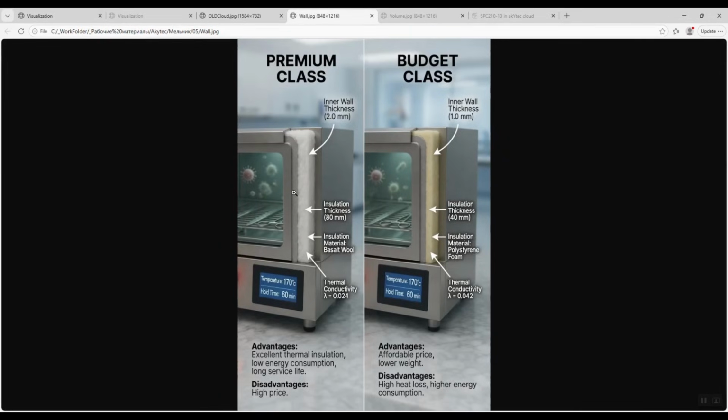The thicker the metal walls and insulation, and the lower the thermal conductivity coefficient of the insulation material, the better the sterilizer chamber retains heat, and as a result, consumes less electricity compared to a second sterilizer with thinner metal walls and insulation, and a higher thermal conductivity coefficient. But this model also has its advantages: a lower price and lighter weight of the sterilizer.